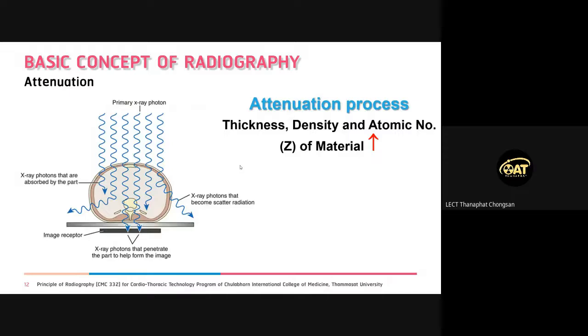Okay. For the basic concept of radiography, the first factor of radiographic imaging is attenuation.